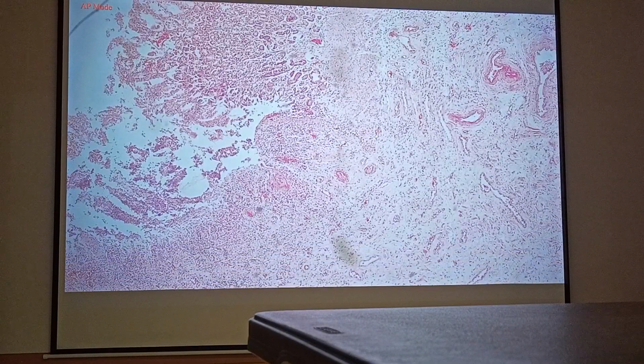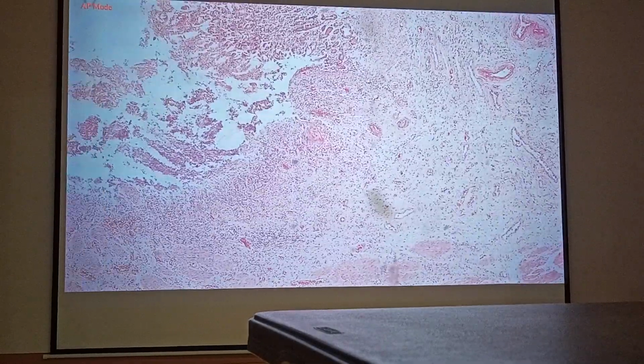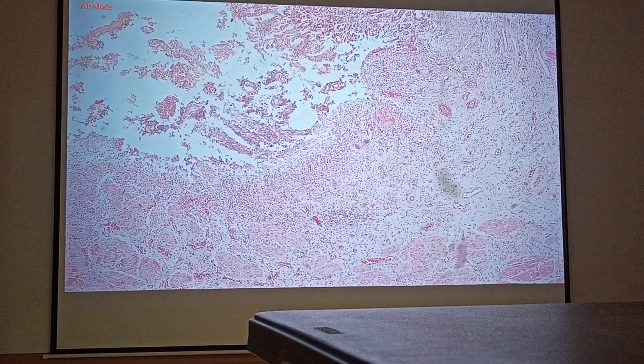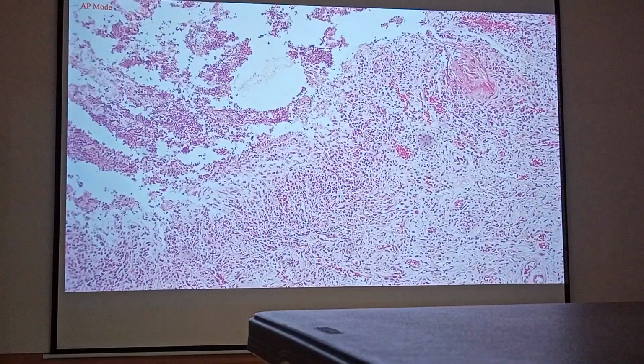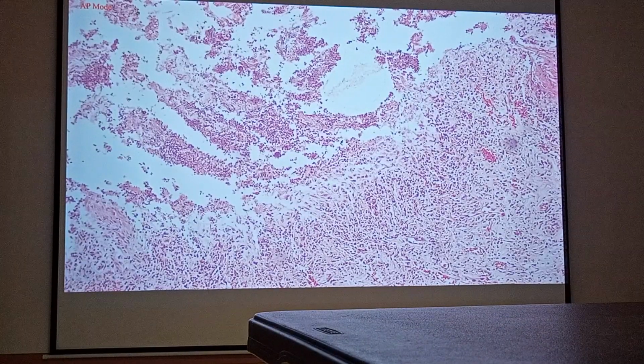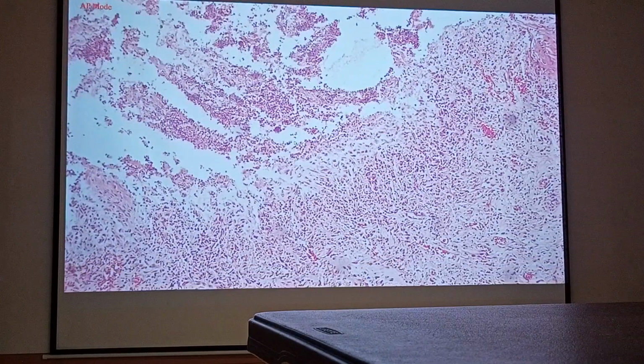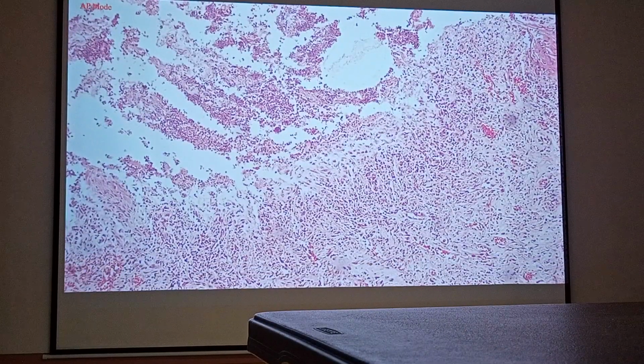If you will examine the base of the ulcer and then the periphery, the margins of the ulcer, you will be able to see the characteristic infiltrates of acute inflammation. Numerous neutrophils at the base and at the margins of the ulcer. And then, at the base also, we will be able to see numerous macrophages.